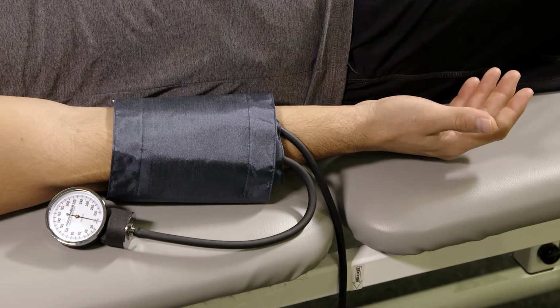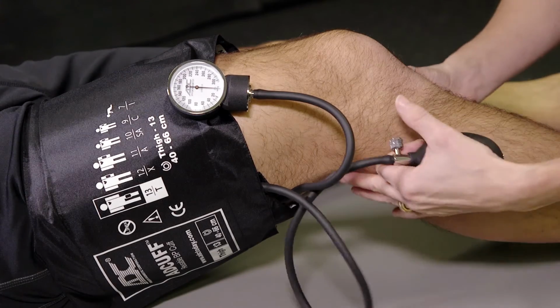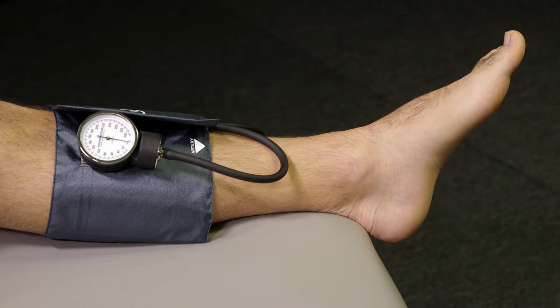In general, measurement at the alternate locations follows the standard measurement procedures and positions, with a few distinct exceptions. First, auscultation of the Korotkoff sounds would take place at the artery below the site of cuff inflation. So instead of auscultating at the brachial artery, as is done with an upper arm measurement, the radial artery would be used for a forearm measure, the popliteal artery for a thigh measure, and either the dorsalis pedis or the posterior tibial would be used for measuring a calf pressure.